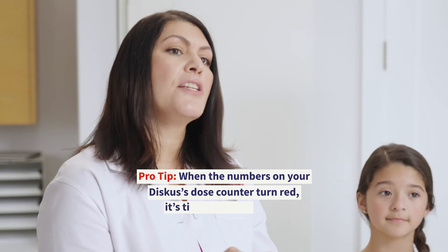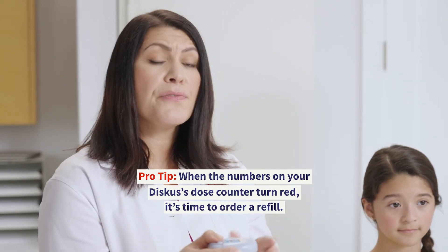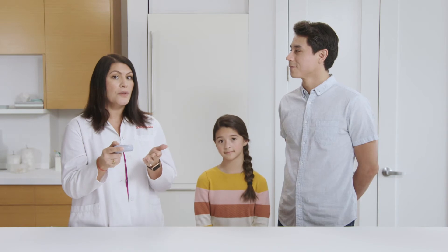Also, be sure to check the dose counter each time you use the Discus for the number of doses remaining, which will tell you when you're running low.